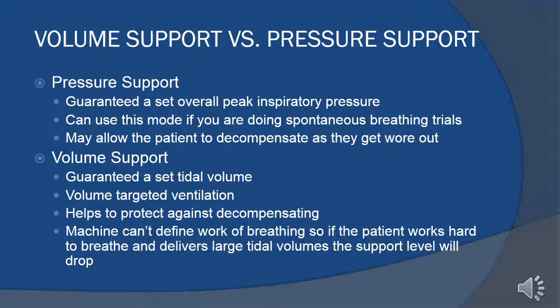And the problem with pressure support now is it may allow the patient to decompensate if they get tired. So what happens? We set the pressure support based on a tidal volume we'd like to see the patient get. So let's say we set the pressure support at 5 or 10 centimeters, whatever. Okay, and you leave the room. You go on what we call a trial. We're doing a pressure support trial. And initially their tidal volumes may be very large, but as they start to get tired, those tidal volumes will start to decrease because the patient needs more support as they wear out.